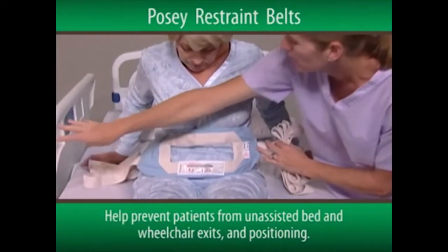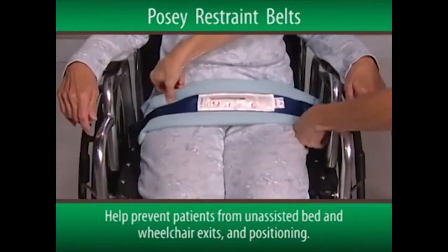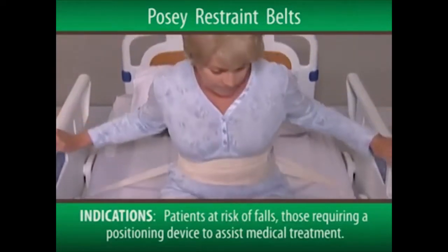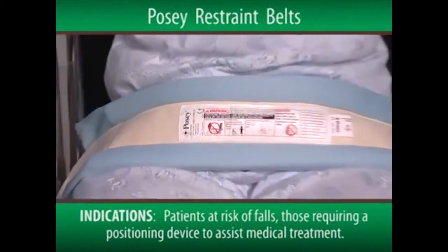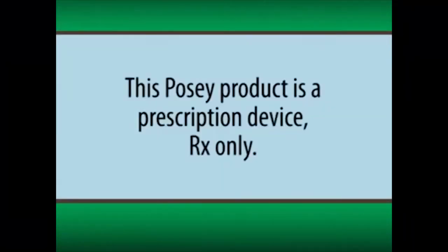The Posey Restraint Belts are used to help prevent patients from unassisted bed and wheelchair exits and positioning. They're indicated for patients assessed to be at risk of injury from a fall, or those requiring a positioning device to assist medical treatment. It's important to note that this Posey product is a prescription device, RX only.